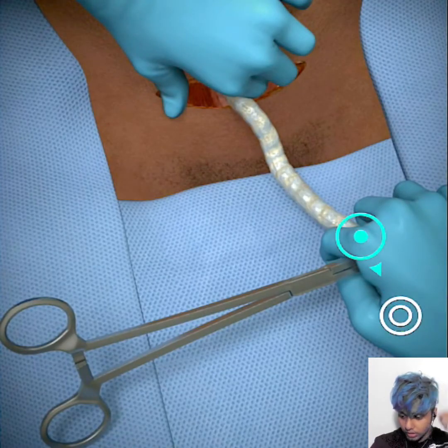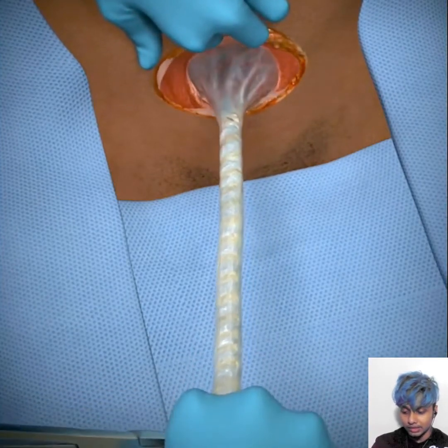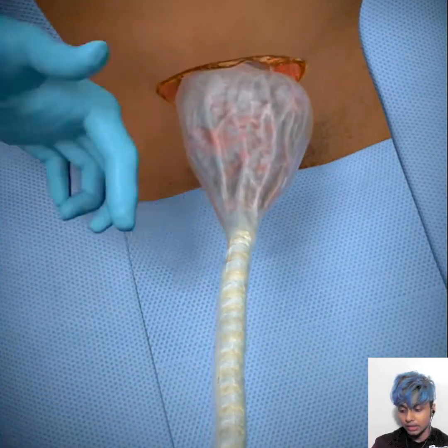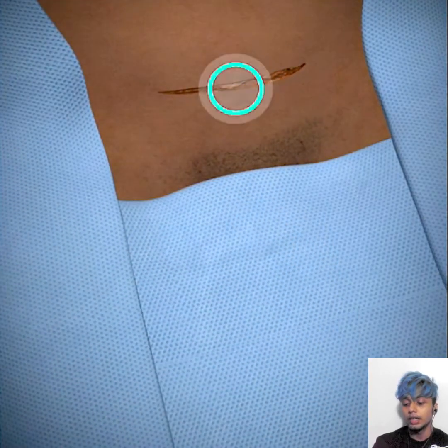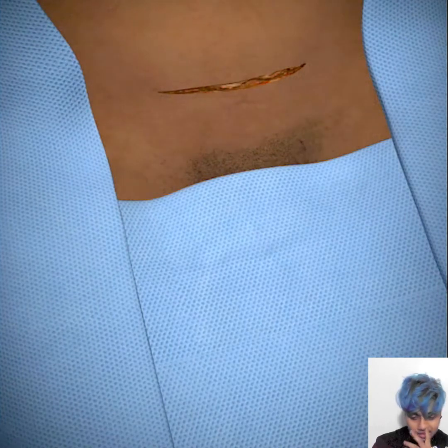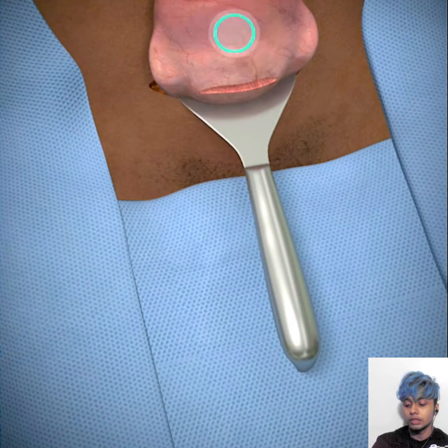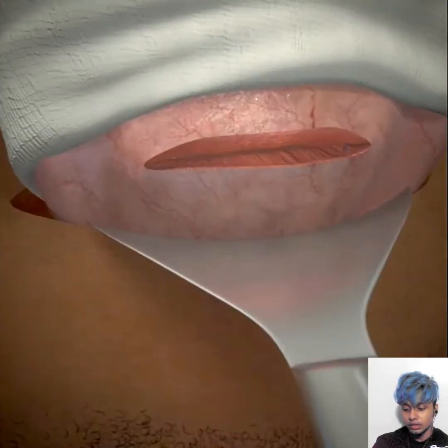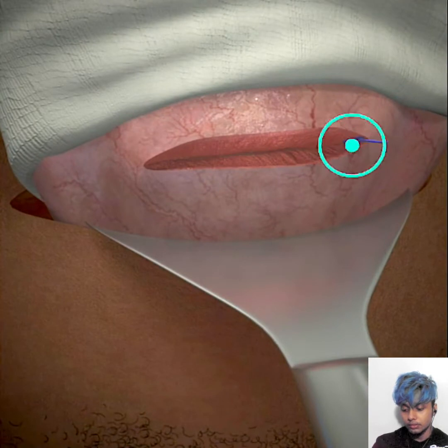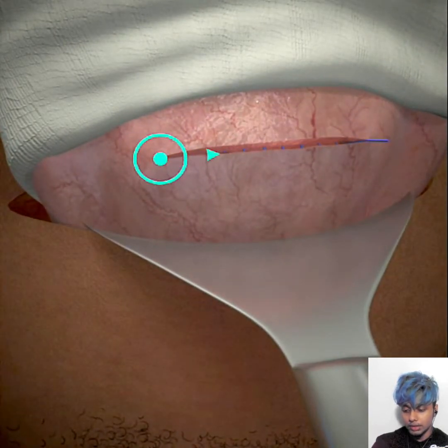Now we have to just put back the stuff that we have cut through and suture it. So this is the placenta. The placenta is a place from where nutrients from the mother's body enter into the kid's body, and it's kind of a storage. We will place swabs around the uterus and tie an anchor knot right there. Continual interlocking sutures would do the magic.